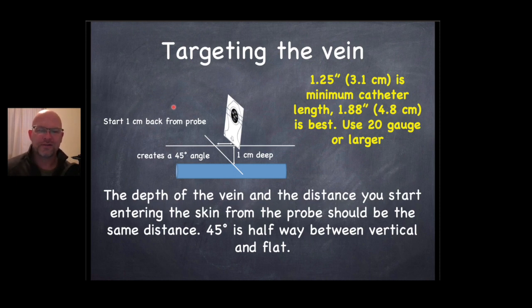So when you're targeting this vein, having the right length IV catheter is very important. Here we have about a 1 1/4 inch needle as kind of your minimum if you're going to go for deeper vessels. If you're just confirming and it's right underneath the skin, let's say they had scleroderma or some type of connective tissue disorder where it's hard to palpate and see what you're going for, but you could look with that and see it. Maybe one of your normal IV length needles would work okay.